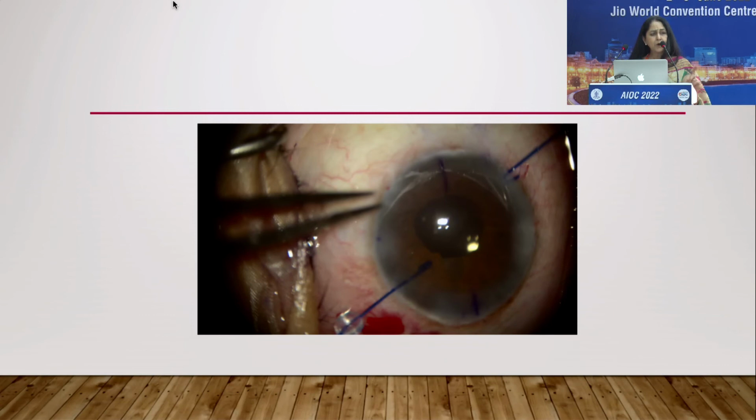And taking out of the iris hooks is also very important. Always make the hook parallel to the iris. Once you've done that, and the visco has to be adequate, then you slowly take it out. Because if you tilt it, you're going to have a DME, Descemet membrane detachment there. So you don't want to do that. So these are the other few tricks during this.